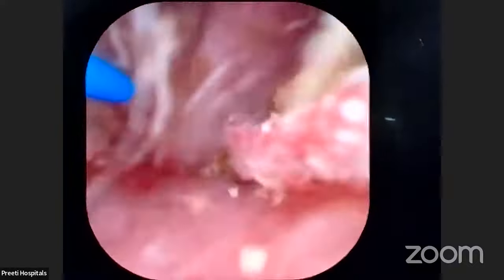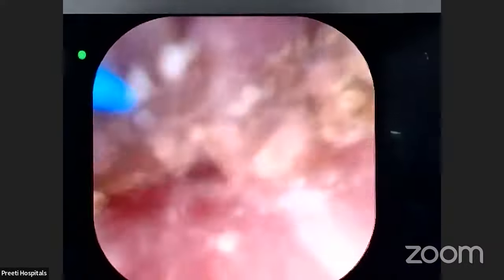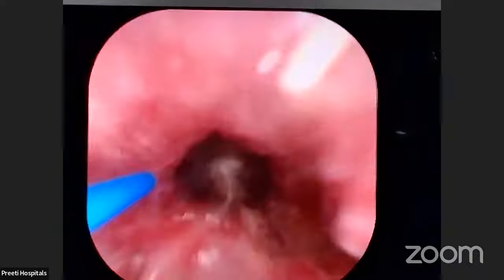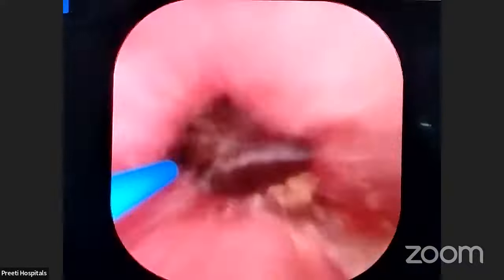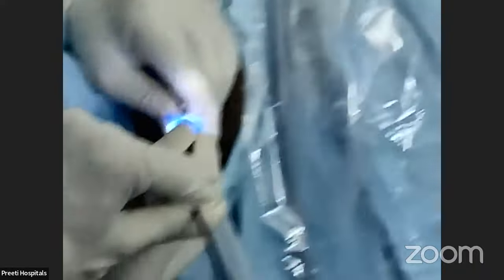just drop by drop. Even I can suck out these fragments also, but to and fro movements by the flexible scope will increase. So I wanted to do a little more time. Now water flush. See how the fragments are coming out. See, if the access sheath were longer, I might have finished much faster. See, now my scope is getting stuck in between the small pieces. Entry. Yes, this entry is difficult. The scope can get damaged if you are rough.